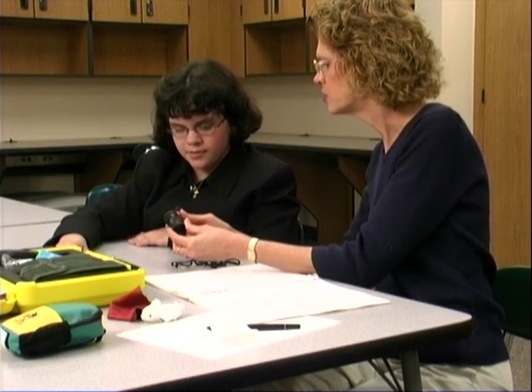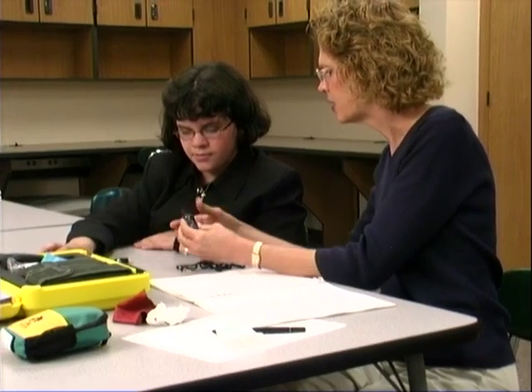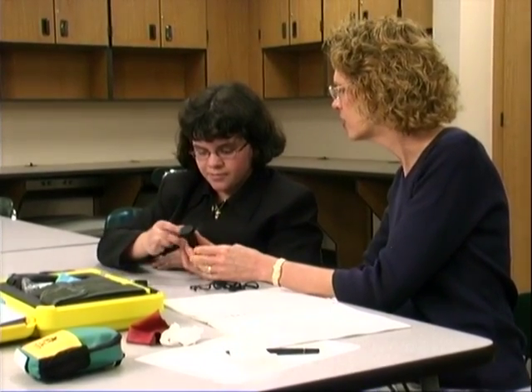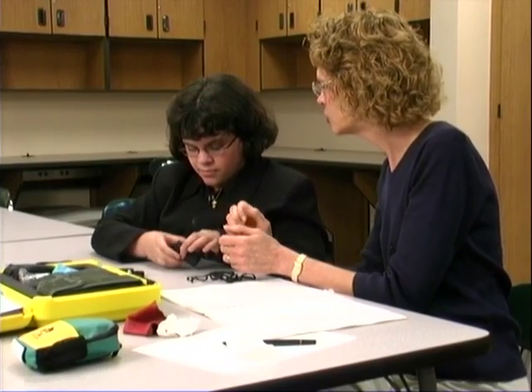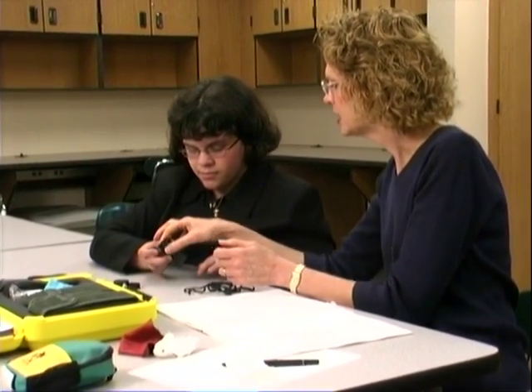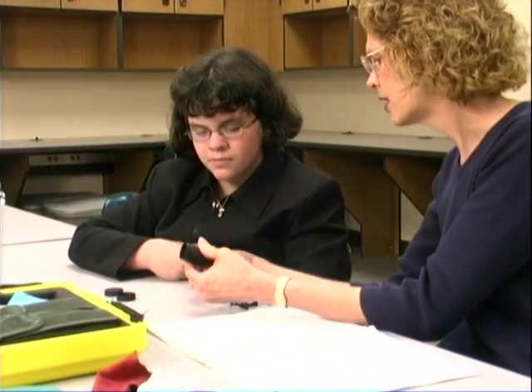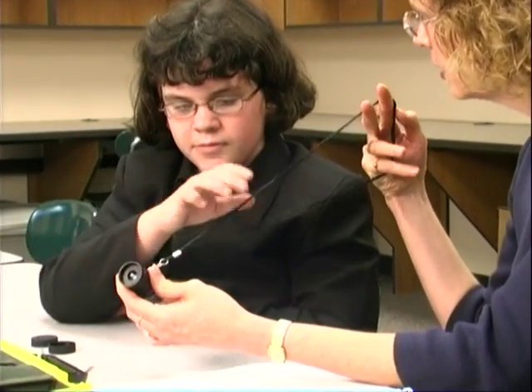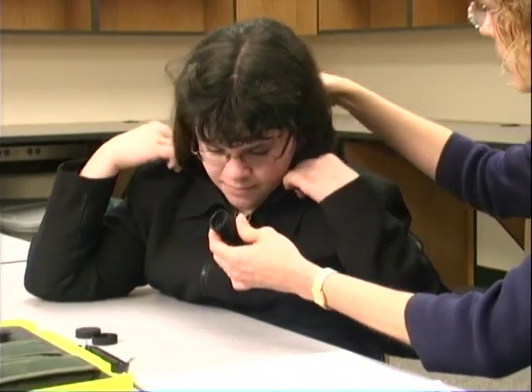There are lens caps on it — covers — and you need to take both of these off. They're just a rubber cap; they come off very easily. Hold it firmly so that you don't drop it. This is called a lanyard, and this hooks onto this little hole right here. Whenever you're using it, I want you to put this around your neck so that you won't drop it. You have to be very careful of it. Go ahead and slip that around your neck.